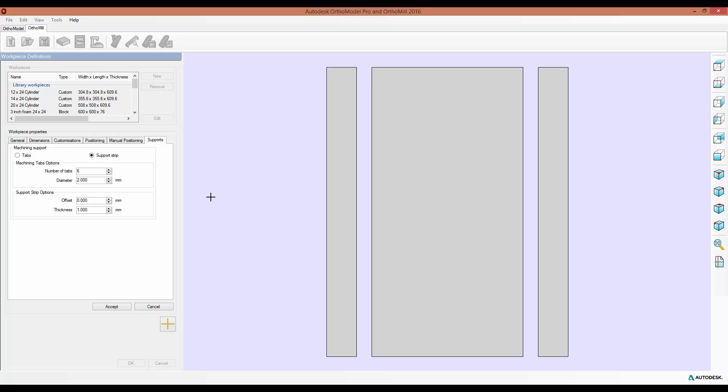And you can also, if you're creating positives or an AFO, set the number of tabs to zero, and this will by default allow you to just machine the part itself. But make sure if you do want the number of tabs to be zero, that you set the Machining Support option back to Tabs rather than Support Strip, as this will make sure that the default option is the number of tabs that you input.